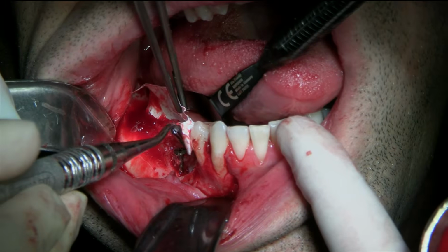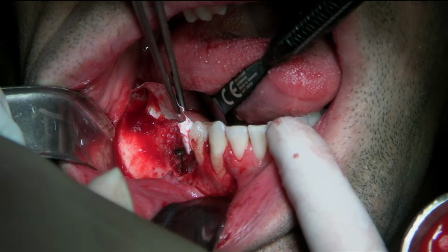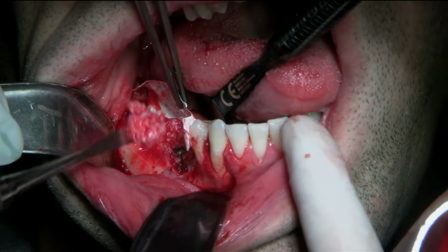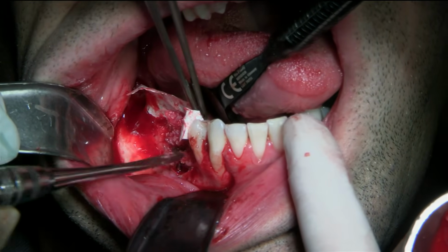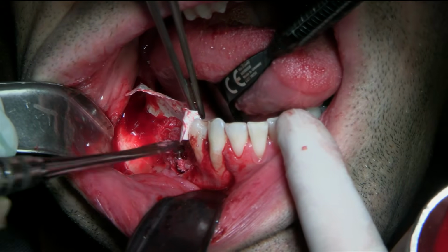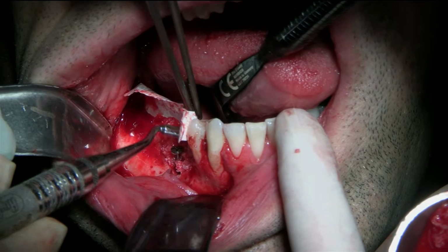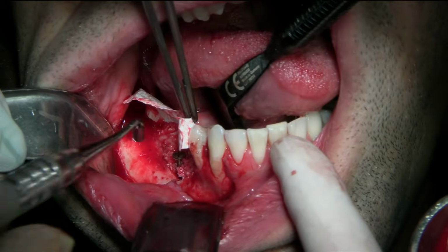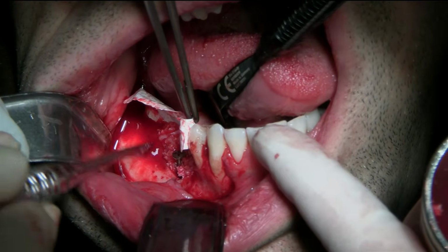So I can nicely condense it against the membrane. I've got some blood there in the back. It's fine. I'll get it to the front.